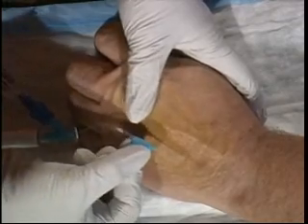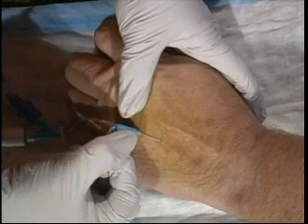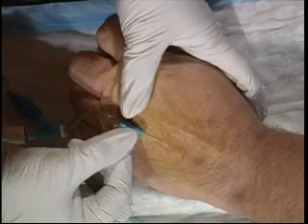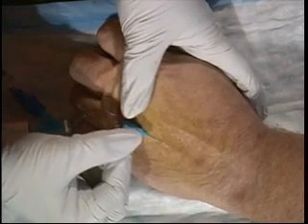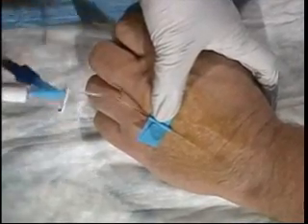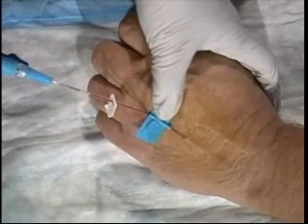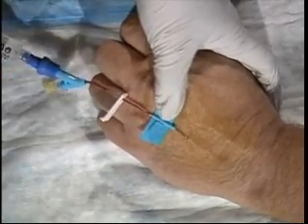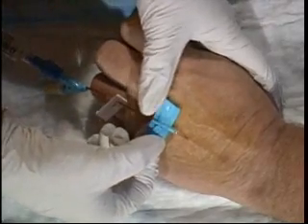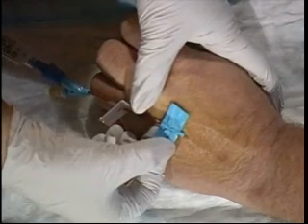And I prepare my patient by telling him I'm ready, and on 1, 2, and 3, insert into the vein, and you can see the blood return coming back into the catheter extension, and I just begin to insert my catheter. At this point in time, I will now withdraw my stylet. This is part of the safety mechanism. I don't want to impact or cause further damage to the vein, but I want to make sure that I can still insert my catheter by gently inserting into the lumen itself.